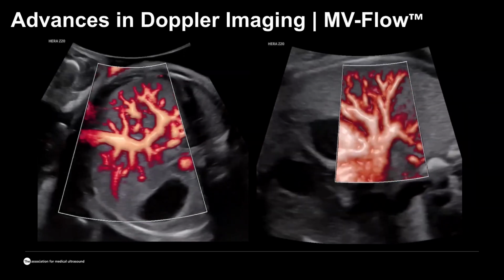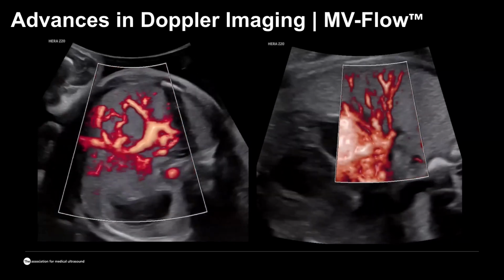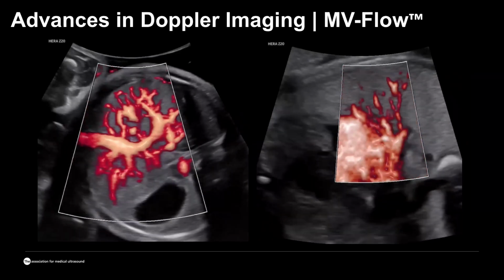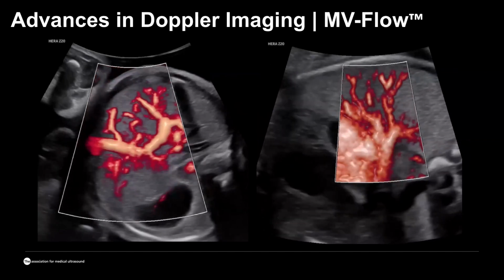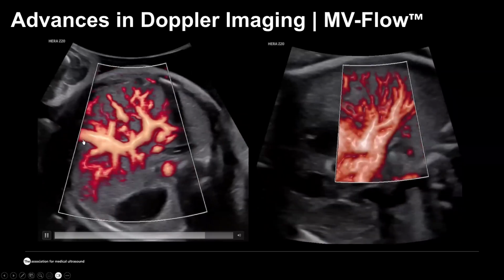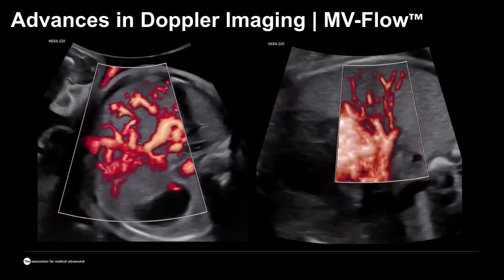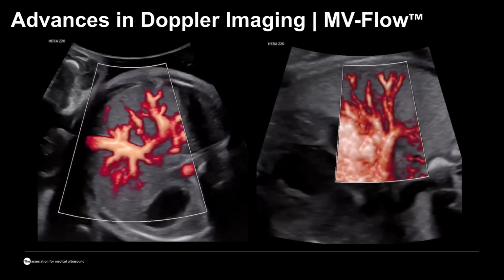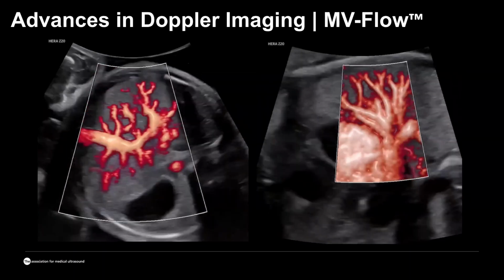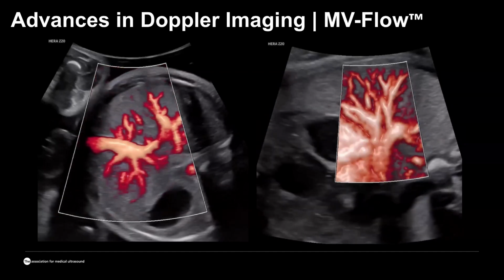As we said, the microvascular flow, or the MV flow, is in particular helpful when we are looking at the pulmonary circulation, in particular the pulmonary veins, and when we are looking at the vasculature of the liver, which is very complex and includes the umbilical vein system, the portal vein system, ductus venosus, and hepatic veins. This is something that is really useful to apply, especially when you're scanning fetuses prior to 20 weeks gestation.